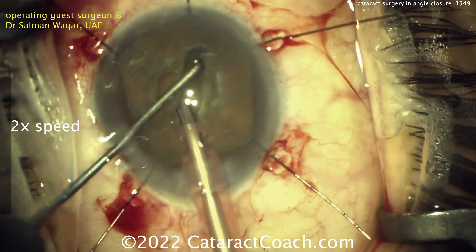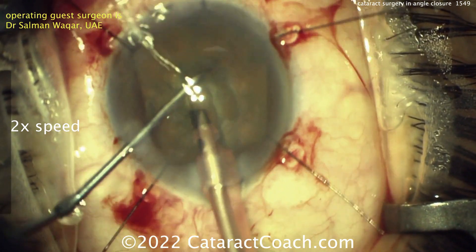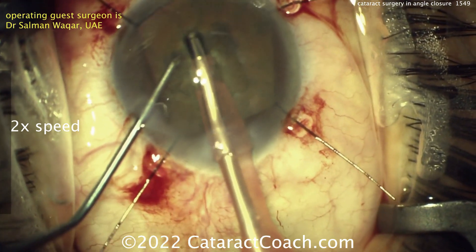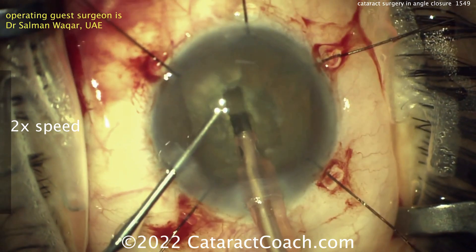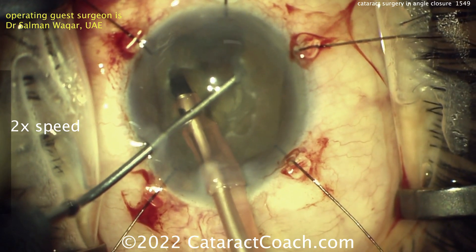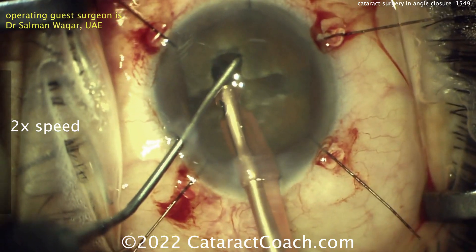Here we go — the initial groove being done, and this is also the densest part of the nucleus. Now rotating it 180° to continue the groove. I like that idea as well. Sometimes in these small eyes, especially with a smaller rhexis, you can't access that subincisional space too well, so getting that rotator 180° is very helpful. Now splitting the nucleus, cracking it, separating the two halves — a divide and conquer.